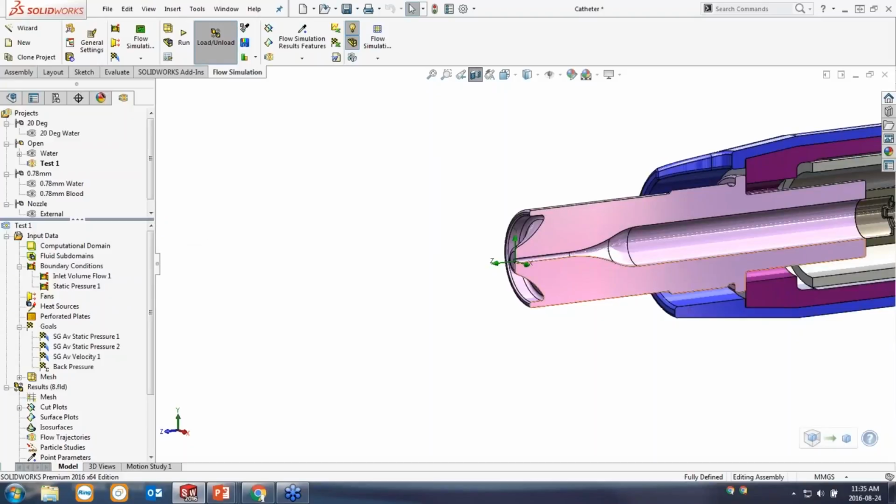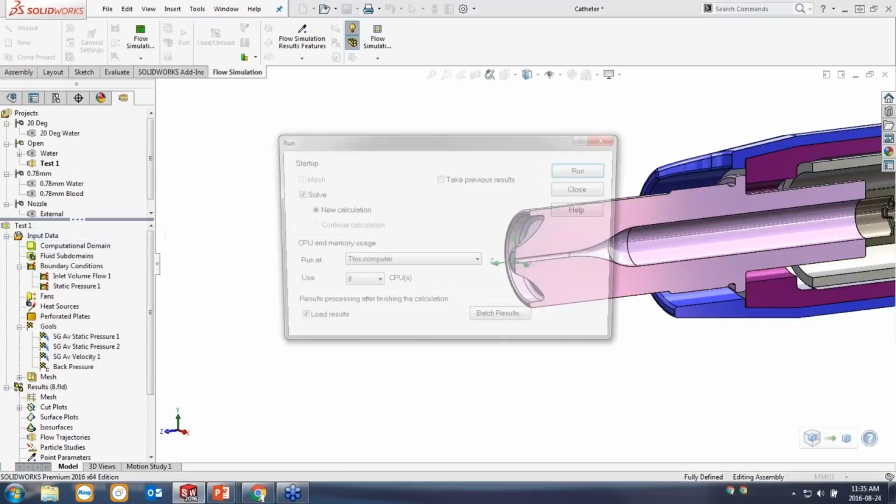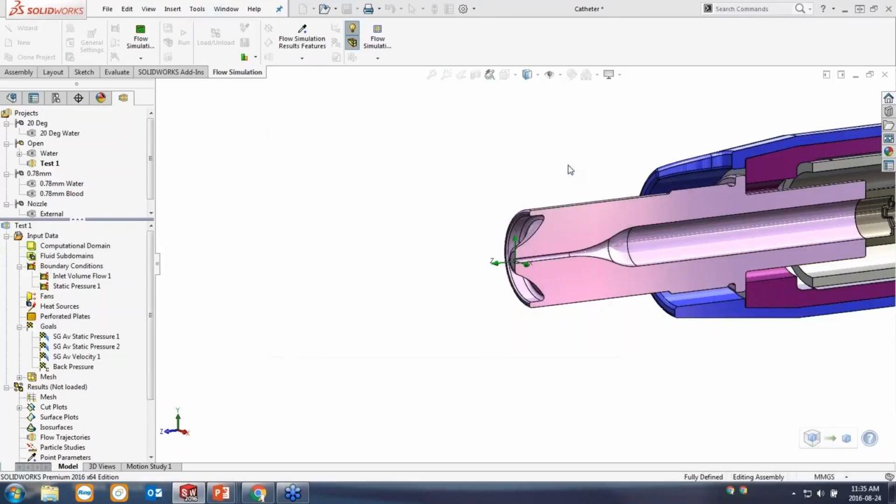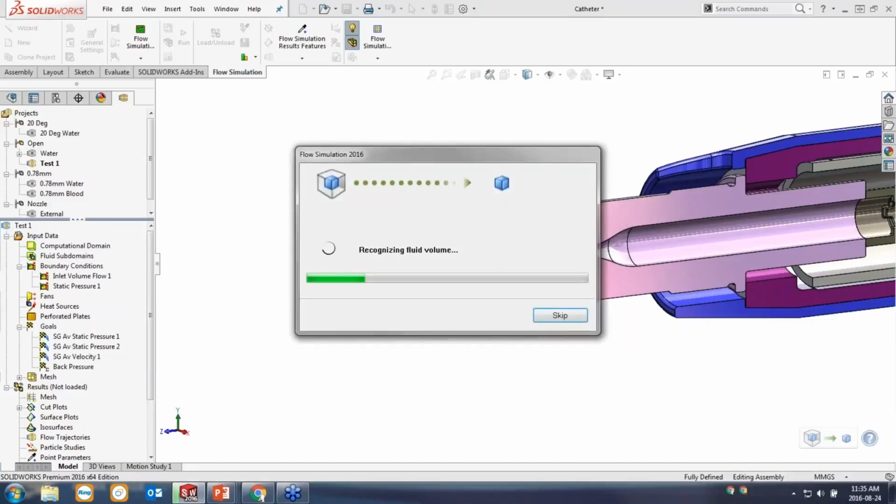So where was I? Right, I just updated the geometry and I'm back in my Flow Simulation tool. All I need to do is hit run, and it's going to solve a new solution based on the new geometry. Notice that I didn't have to run through the wizard again. I didn't have to apply a new inlet boundary condition, a new outlet. I don't have to redefine my goals. They're all exactly the same. All I have to do is click that button, maybe walk away for 10 minutes, grab a coffee, come back, and I'll have new results, and I'll find out whether 0.6 millimeters is large enough.